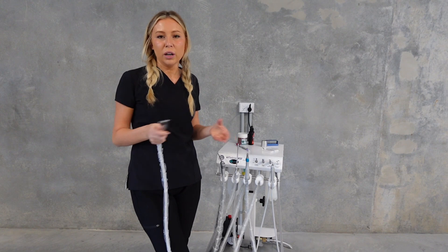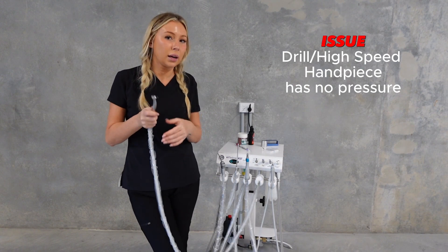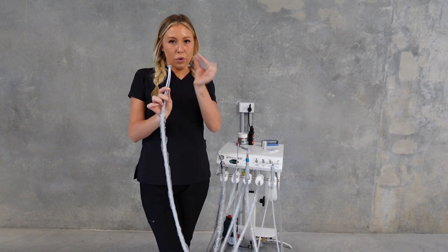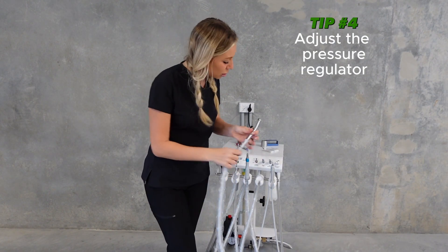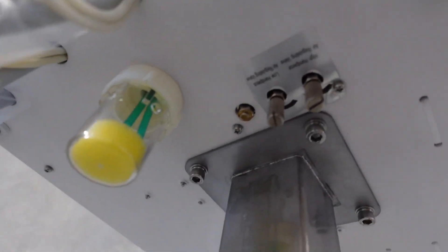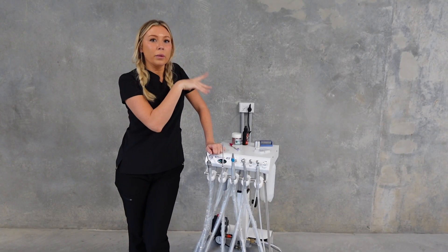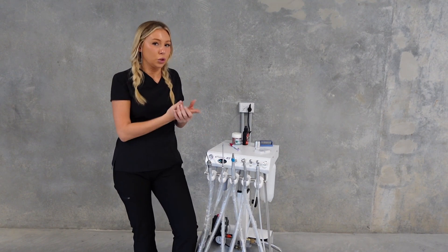With the high-speed handpiece, say the vet is trying to burr some teeth, it's got no pressure - lots of water coming out but they're struggling and can't cut through the teeth. A lot of people don't realize these machines have pressure regulators. They're located under the machine, tucked right at the back - there are two, next to each other, one for the high speed and one for the low speed. You can adjust those; sometimes they just need a little tweaking. Don't put them too high or too low.